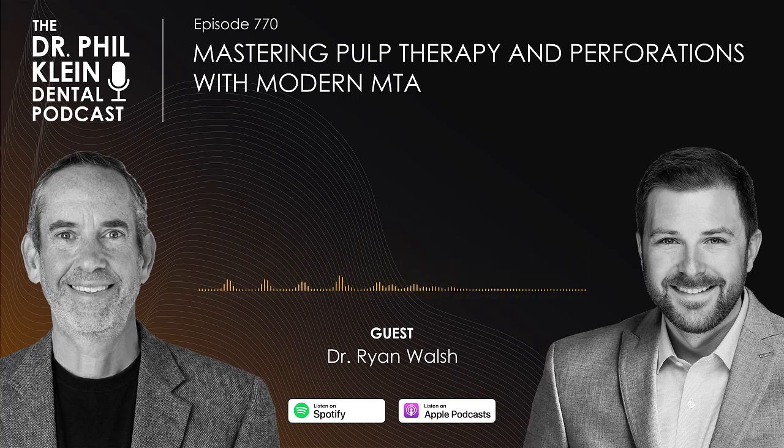What about a crown though, where there's more of an investment? There's more chair time involved, and then we have that pulp exposure to worry about. Would you avoid the crown and just go with the direct restorative if you could, and then in a certain amount of time, knowing that you essentially need the crown down the road, do it after you start to see some form of dentin repair radiographically, or it won't even bother you to go straight to the full coverage?